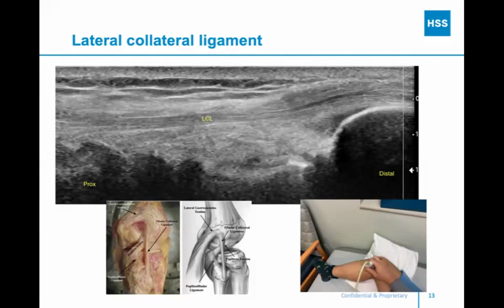And just from a what-do-you-expect standpoint, most of these are medial, but we definitely see them lateral. And my experience has been they're usually a little bit more symptomatic lateral. People coming in for them tend to be more bothered laterally. I'm not exactly sure why that is. They're almost always associated with a horizontal cleavage tear. And for almost everyone, you should be able to see that cystic structure extend to a cleavage tear. So if you see what you saw and you see that extending to the cleavage tear, which is what you saw on the meniscus, that was a great pickup as well. Those are almost always parameniscal cysts, unless proven otherwise.